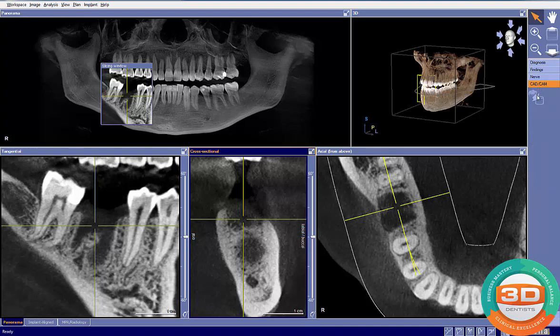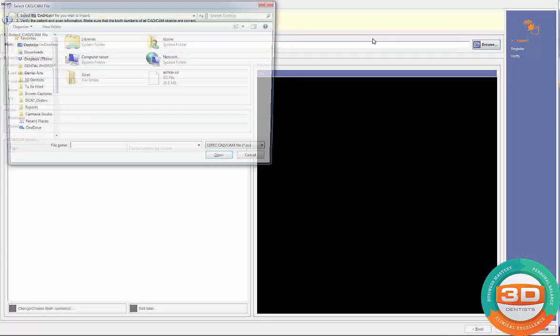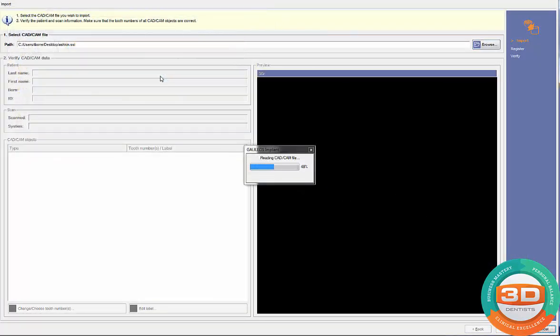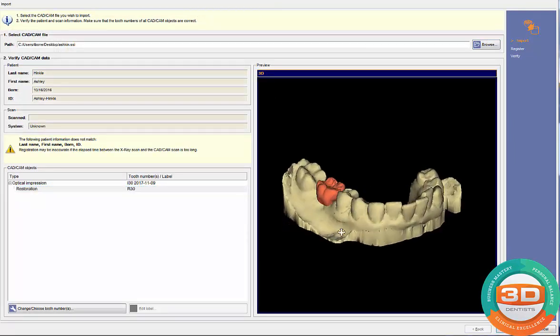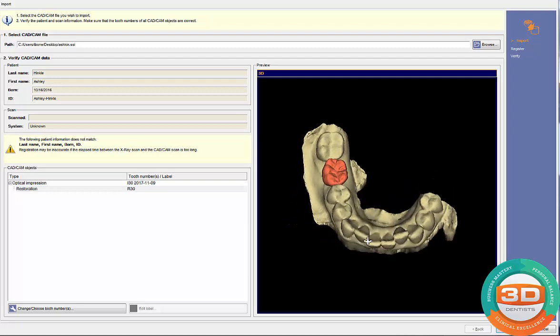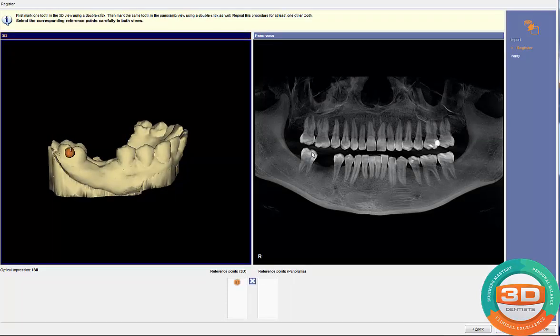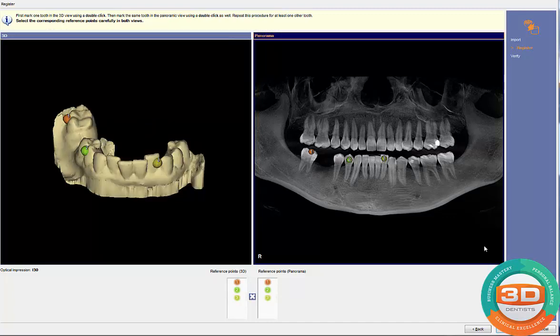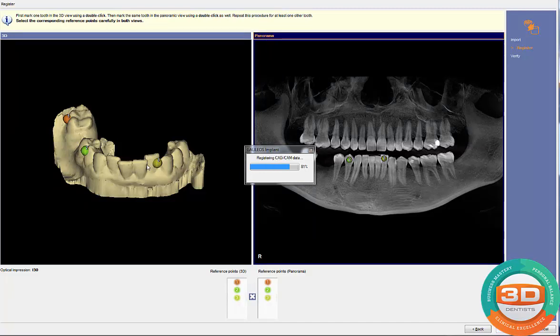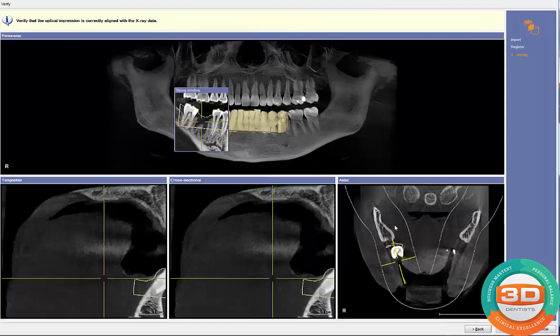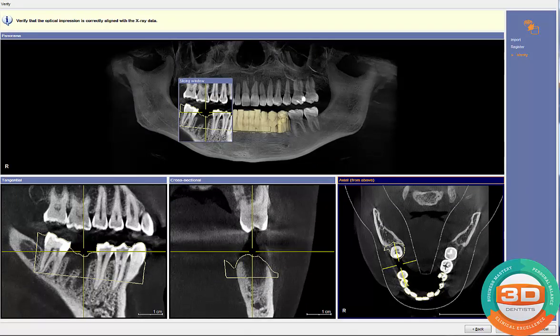When you open the CAD CAM tab, you may find you can't click the button to import because your license is not active. You want to make sure your license is activated. Click the license on, then browse to where your SSI file is and import the SSI data. Here you can see we captured three quarters of an arch for maximum stability of the surgical guide. The software automatically registers the CEREC data and you can verify that the registration is accurate.